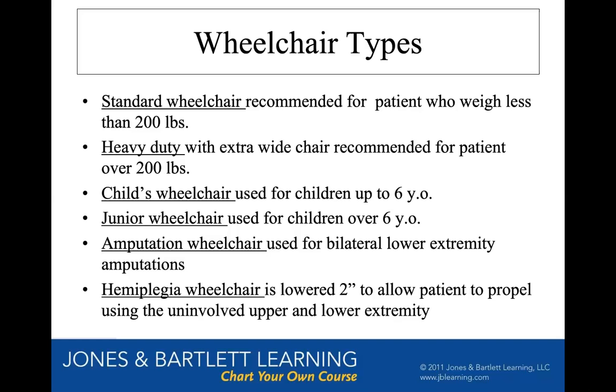So if my left arm and leg were the hemiplegic sides, then I could use my right arm to propel on the wheel, and I could use my right leg, my foot, to propel myself along too. And you'll see a lot of people that have strokes. That's how. And if they're people that have strokes or brain injuries, if they end up in manual wheelchairs as their means of mobility, a lot of them use that one arm and one leg method to drive. And it's pretty functional.